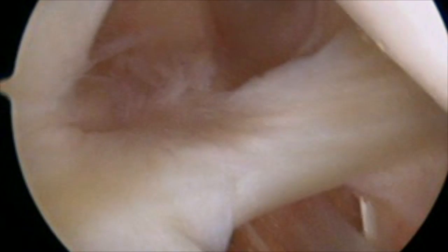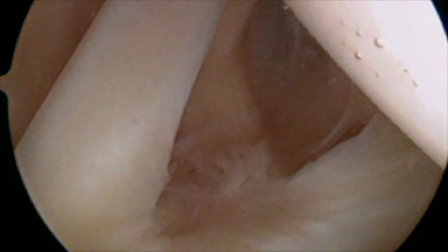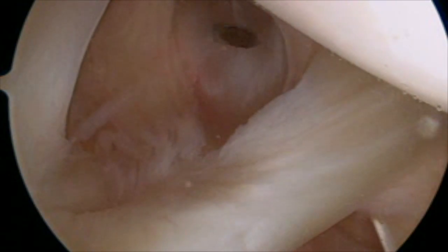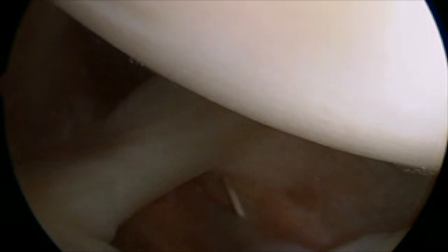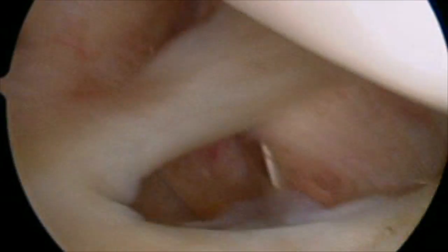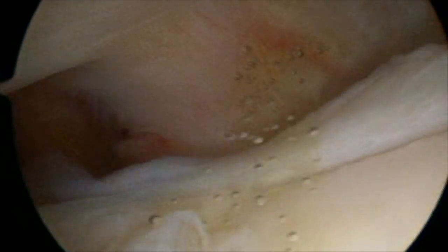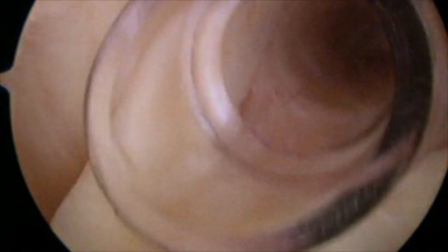So after the quick tour, the next step is to actually establish a second portal or entry site into the joint from the front, and use a spinal needle to actually determine the correct spot for that. It's very spot dependent — even off a couple millimeters can really change your ability to access the joint. So once we find the spot, we make a small 4 to 5 millimeter incision, and then introduce what we call a cannula. You'll see a little orange blunt tip kind of spear coming into the shoulder — that's the obturator for the cannula. And then we deliver the cannula in. The cannula is a clear plastic tube with a valve that allows us to put instruments in and out of the joint without traumatizing the soft tissues every single time we do it.